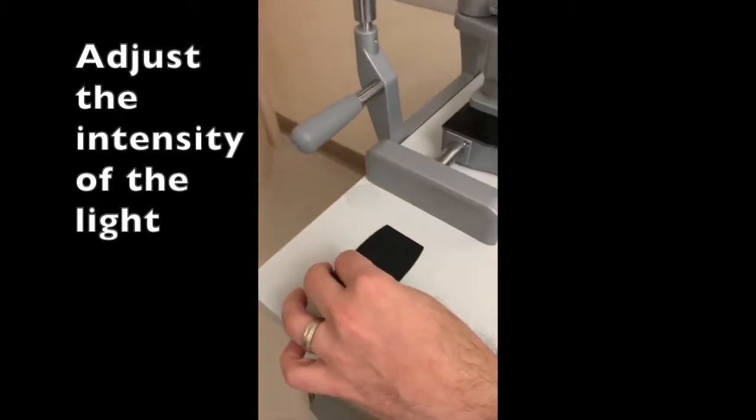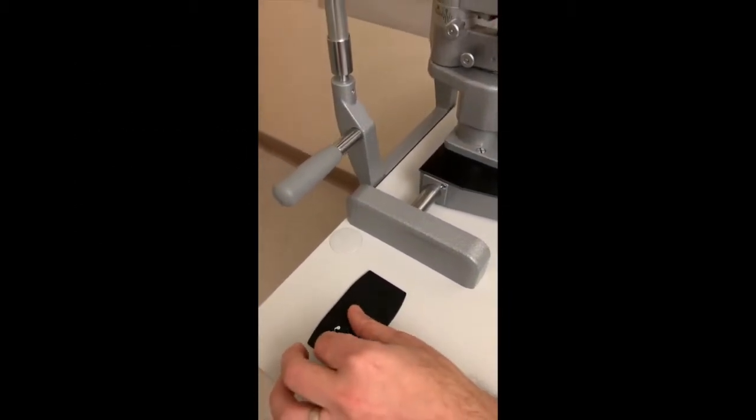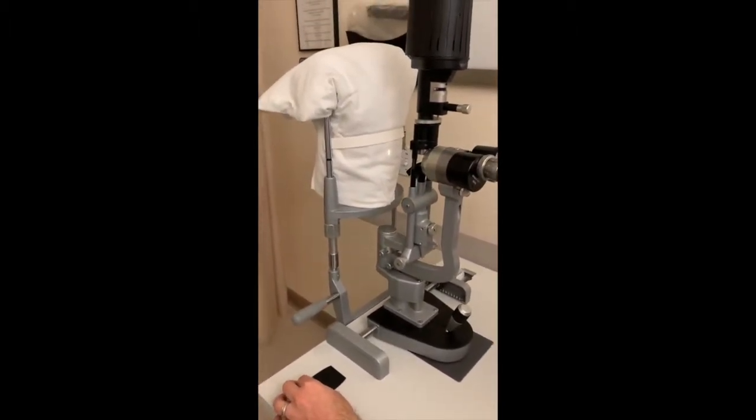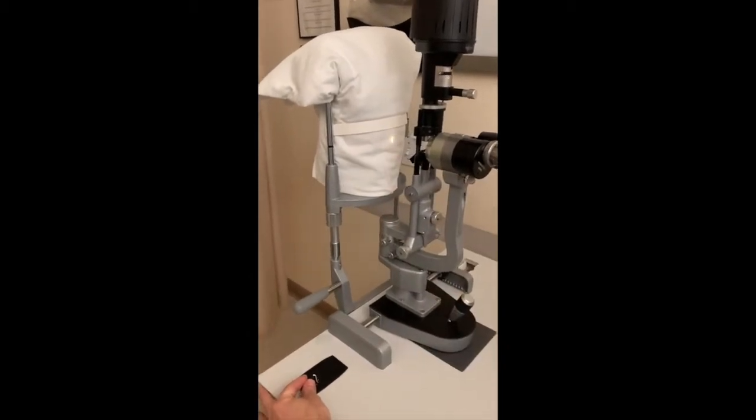So when I walked up to this machine, the light was off. So if I didn't know that, I would think it's broken. So now I have to turn the light on and adjust the intensity.